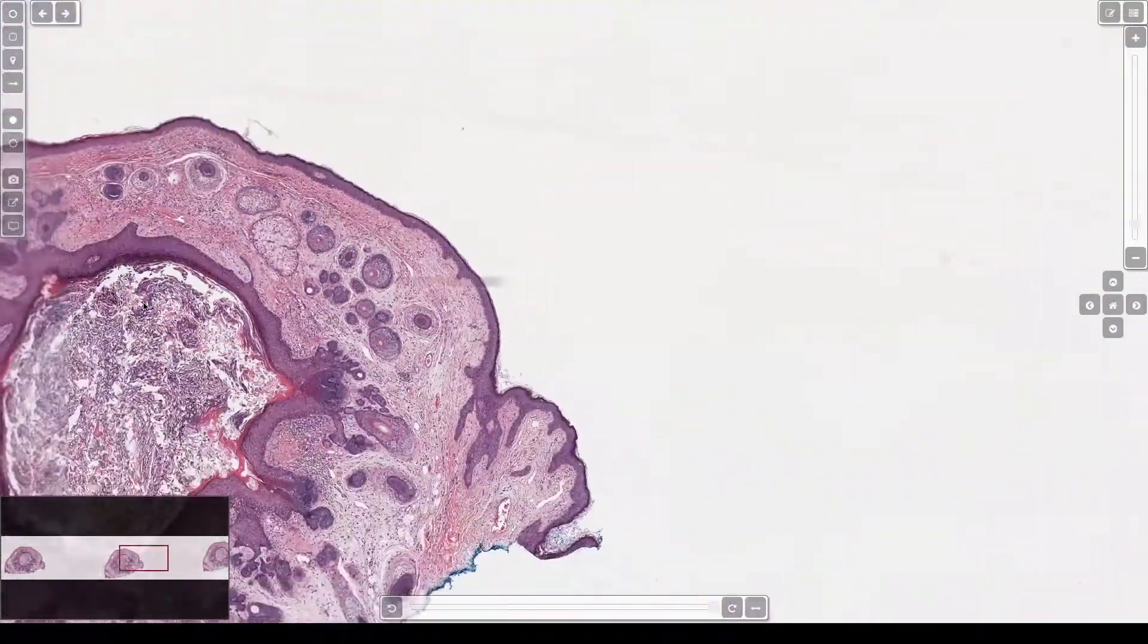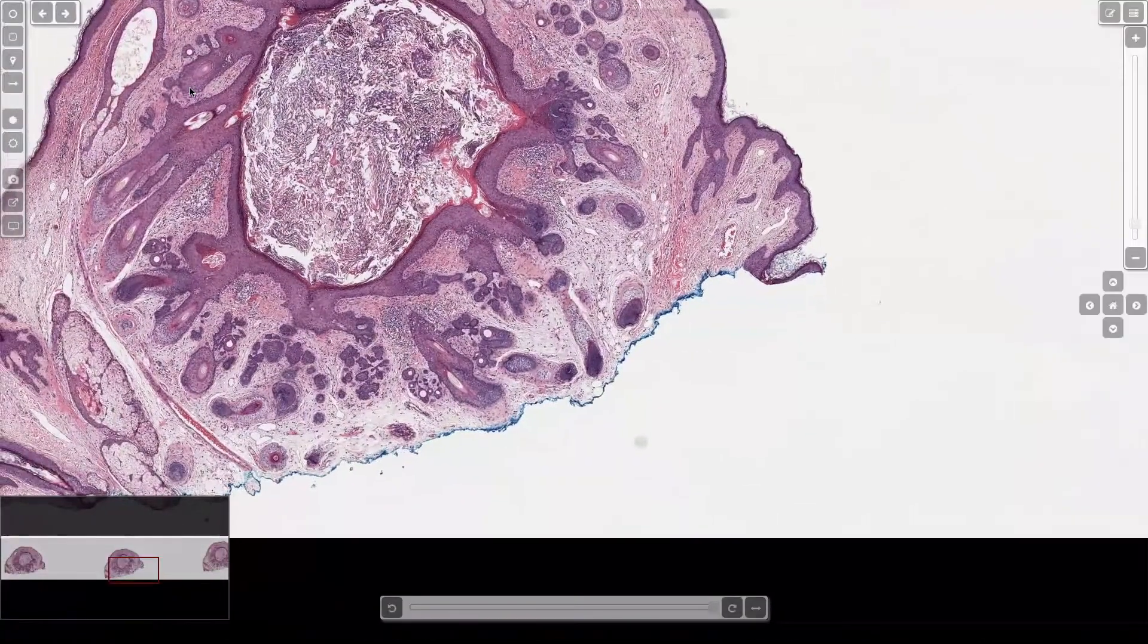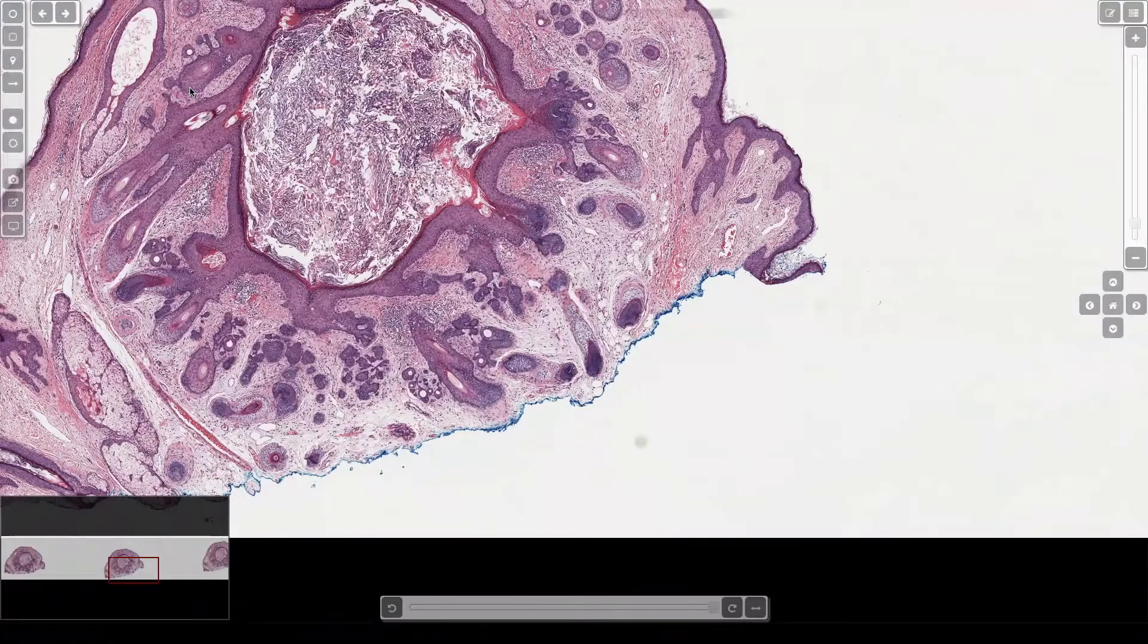And a lot of times if you look from lower power, you can see that the whole lesion tends to be, it's a little harder to appreciate here, but it tends to be wrapped in a fibrous stroma, which is analogous to the adventitia that lines around normal follicles.